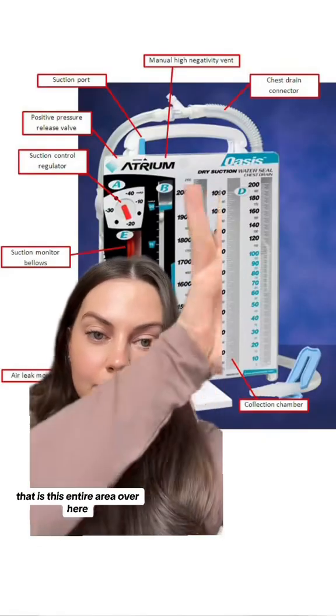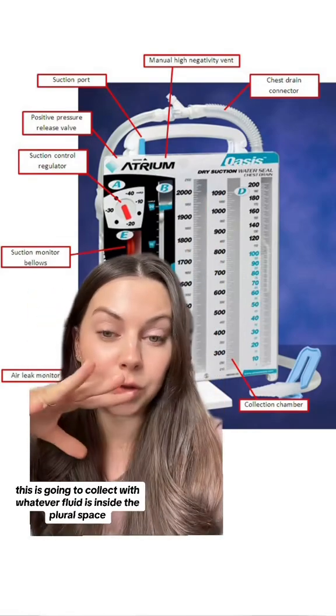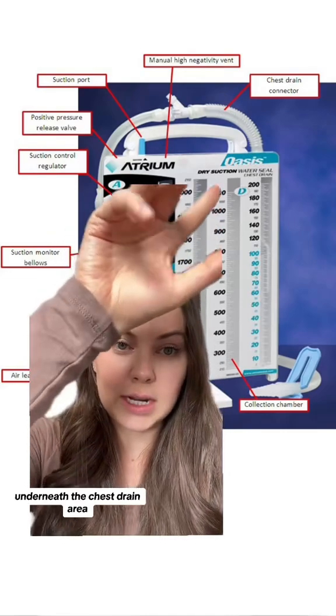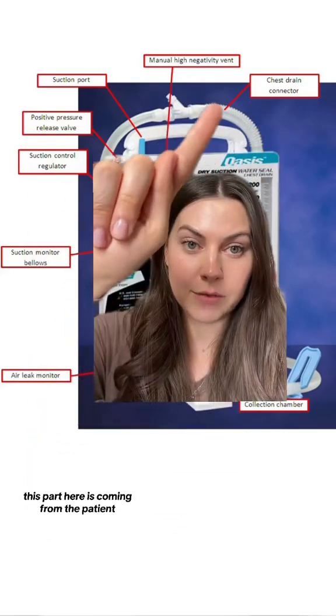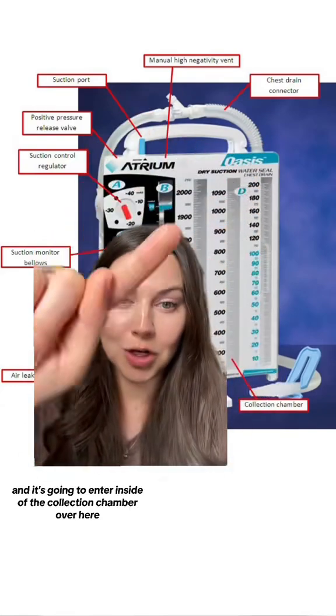That is this entire area over here. This is going to collect whatever fluid is inside the pleural space. And you can see that the collection chamber is right underneath the chest drain area that's coming from the patient. Let me move myself so I can point. This part here is coming from the patient and it's going to enter inside of the collection chamber over here.